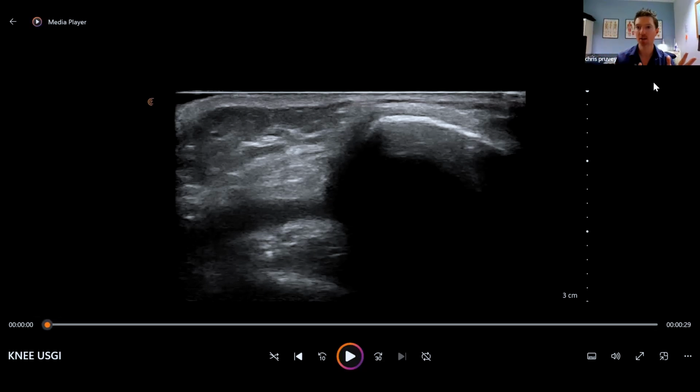We can't keep injecting at those regular intervals. If it lasts 6 months and you're trying to stave off a knee replacement for a couple of years, well, let's get another 6 monthly dose in, and another one. So it depends on goals. The only exception would be if people have a really highly inflammatory disorder, frozen shoulder being the classic. I've occasionally seen people recently who failed an unguided injection, failed one guided injection, and really don't want surgery, so we've attempted another one in fairly quick succession, looking at the dosing and everything. Yeah. Thank you very much.